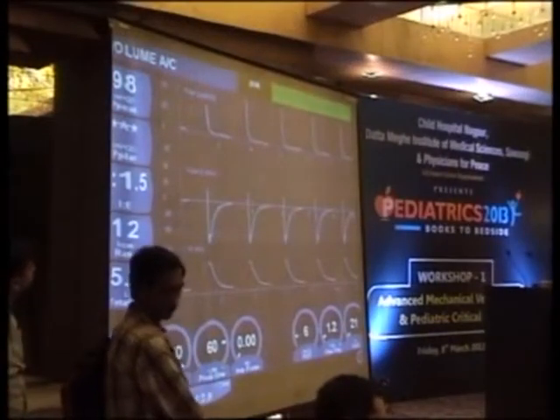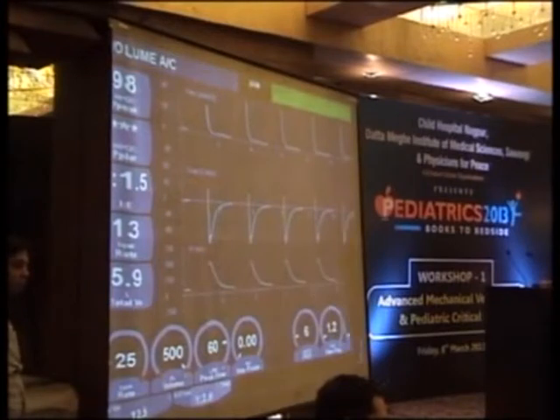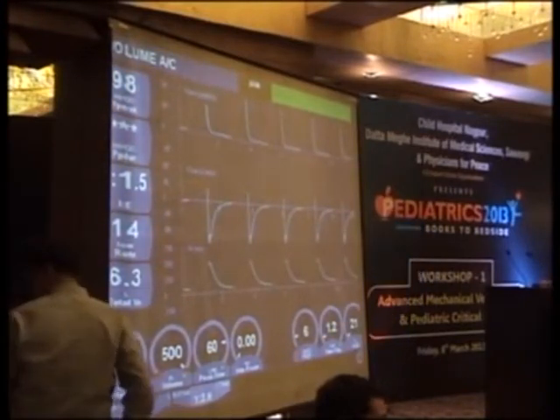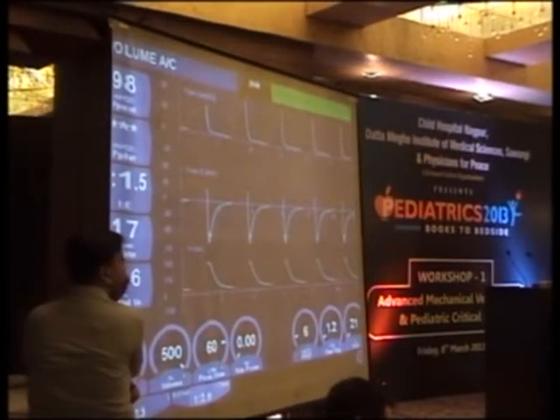Okay, can you get the ventilator to hook up to the LCD? She has severe labored breathing, and she came up. She is on Heliox, and we've tried non-invasive ventilation with her, and she is severely and profoundly hypercarbic on the mechanical ventilator. And we've just intubated her.